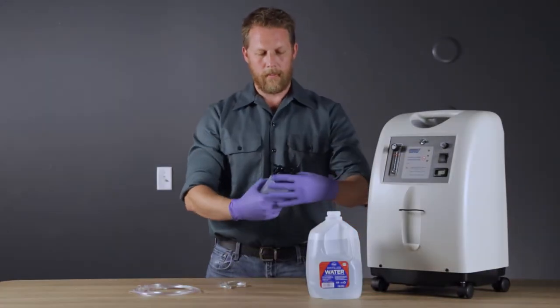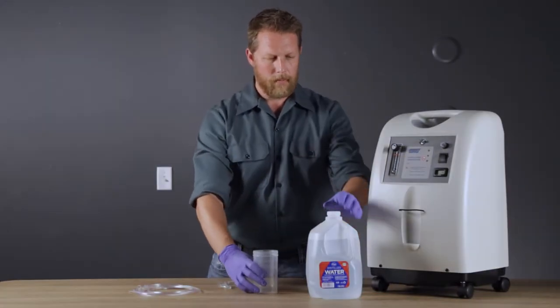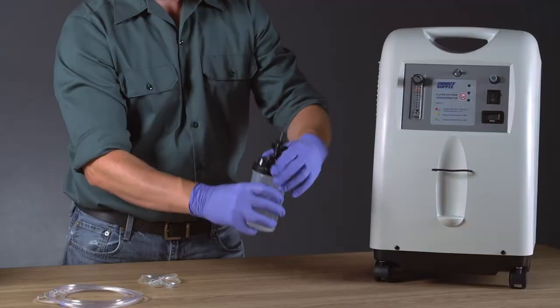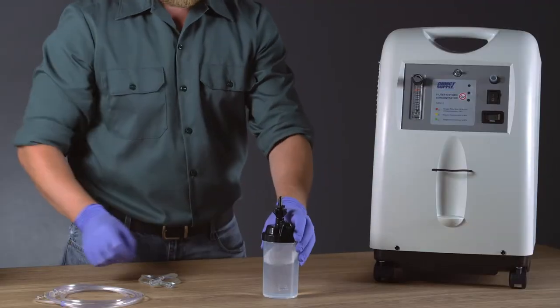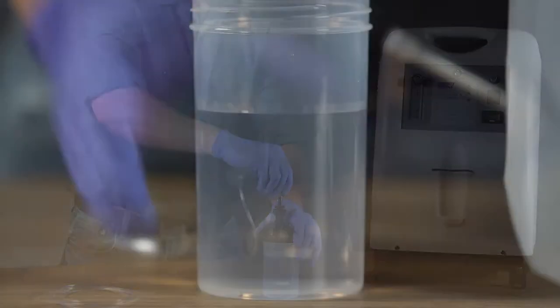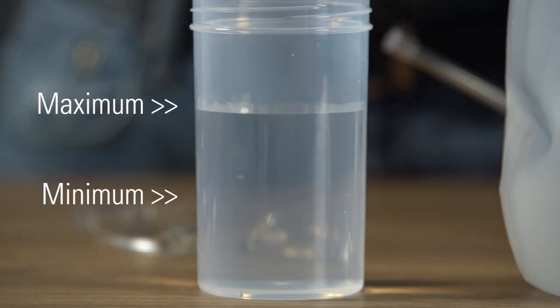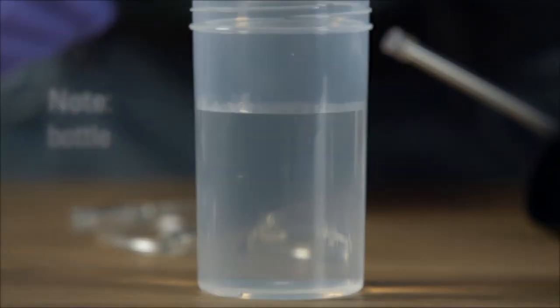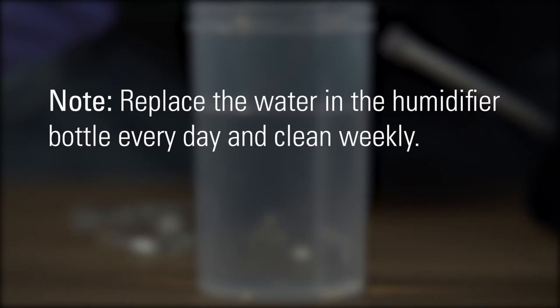After removing the cannula and humidifier bottle from their packaging, unscrew the cover of the humidifier bottle. Add purified or distilled water to the bottle. Ensure the water falls between the minimum and maximum indicators on the side of the bottle. Note, replace the water in the humidifier bottle every day and clean the humidifier bottle weekly.